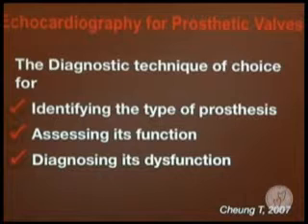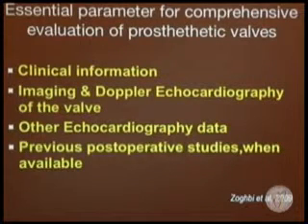Echocardiography is demanding in performing and interpreting. Echocardiography, TEE and TTE, is the diagnostic technique of choice for identifying the type of prosthesis, assessing its function, and diagnosing its dysfunction. We have to obtain a comprehensive evaluation of prosthetic valves: clinical information, imaging and Doppler echocardiography of the valve, other echocardiographic data, and any available previous post-operative study.